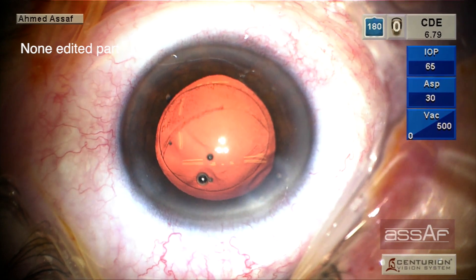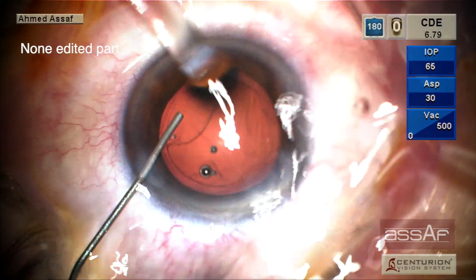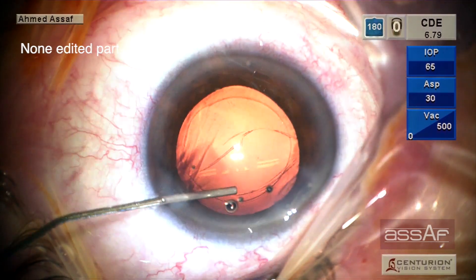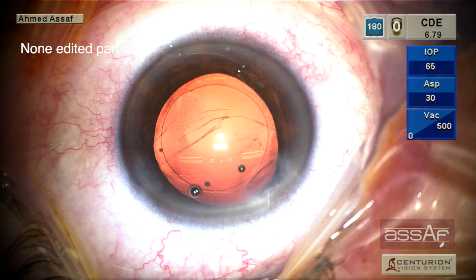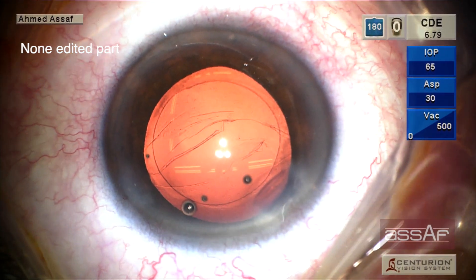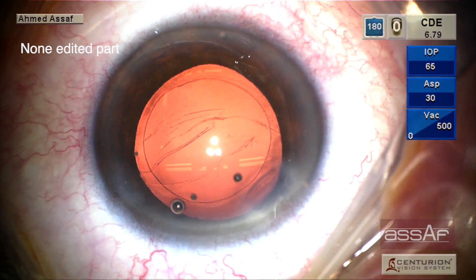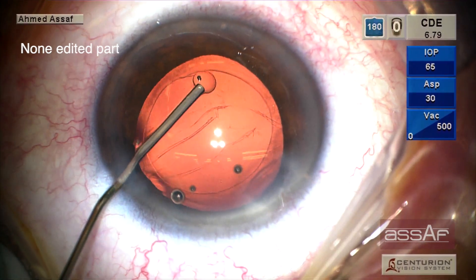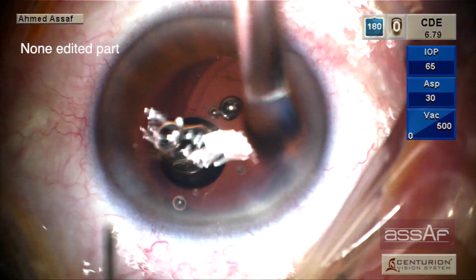My first reaction was immediate injection of OVD inside the capsular bag, trying to prevent vitreous from prolapsing into the anterior chamber. At that time, the only available OVD was cohesive OVD, so I injected cohesive OVD, followed by dispersive OVD for further tamponade of the vitreous.